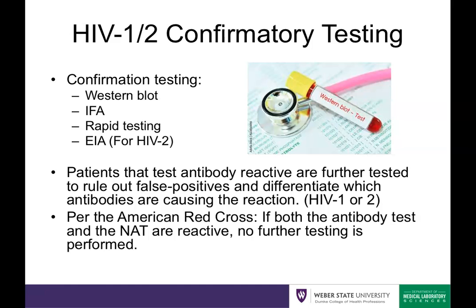Also, per the American Red Cross, in their procedure, if both the antibody test and the NAT are reactive, no further testing is performed. They're able to rid themselves of that blood product.